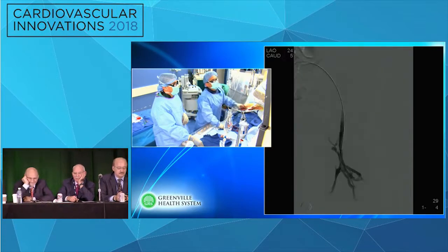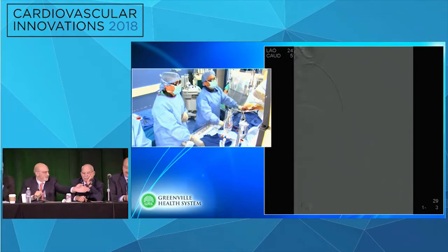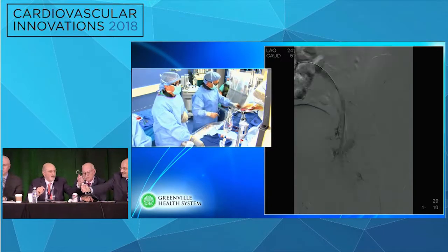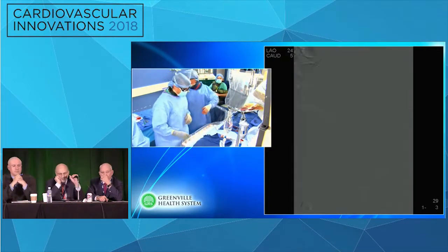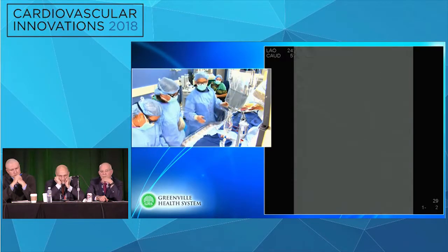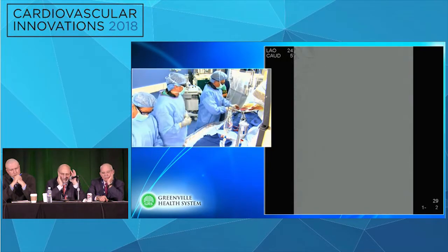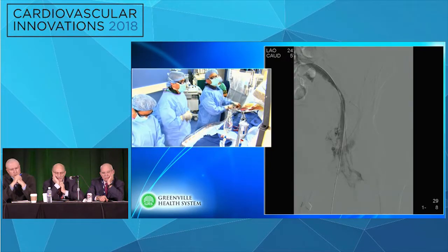Kenny, also below? You're thinking? Please. Oh, sorry. All I can tell you is that I hate to throw this step in, but give me the longest angled catheter that we have. I'm not sure I'm happy where the wire is. Okay, I think I'd probably get the wire into the. I'm not either. That's why I'm going to check that.